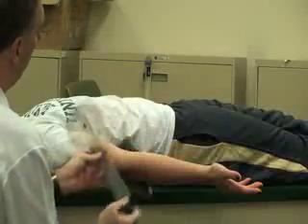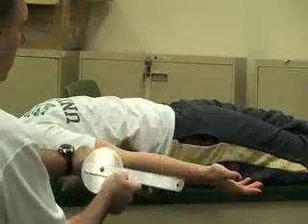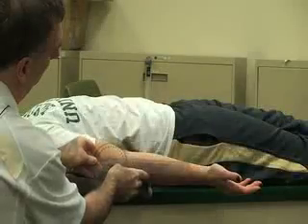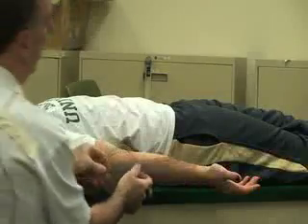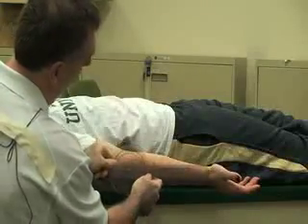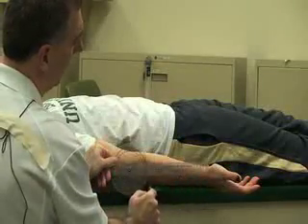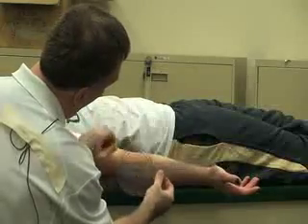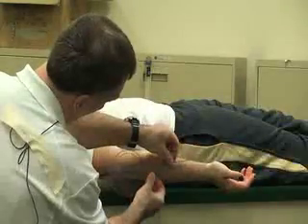The fulcrum for this one is going to be on the lateral epicondyle. The stationary arm is going to be parallel to the floor and the moving arm is going to be in line with the ulna, using the styloid process as a guide. Go ahead and bend your elbow a little bit so I can find it. Go ahead and flex it.